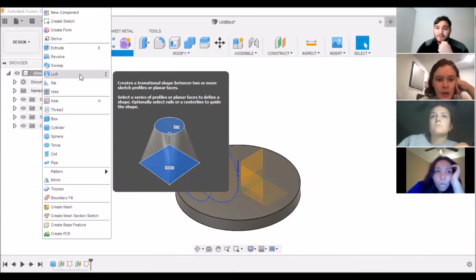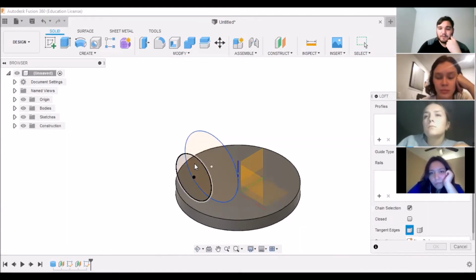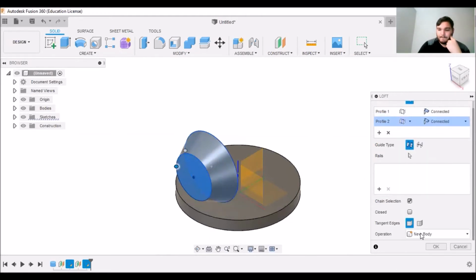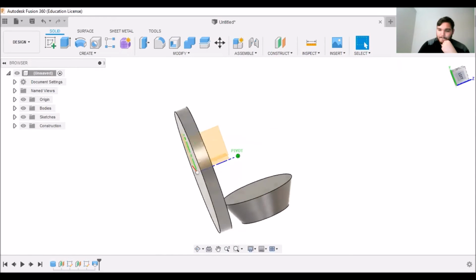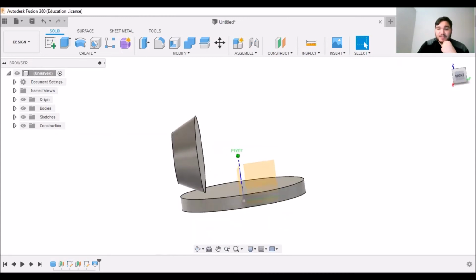Now we can do what's called a loft. So instead of extruding, what lofting does is it takes one geometry shape and then extrudes it to a different geometry shape. And as you can see in the example, you can go from a square to a circle, but in our case, we're just going to do a circle to a circle. So click on the loft from underneath the create dropdown. Gives you a new menu. You can click the first big circle, and then the second little circle, and then press OK. Now we have a little joint cap. And so this is basically just a little bitty frustum.